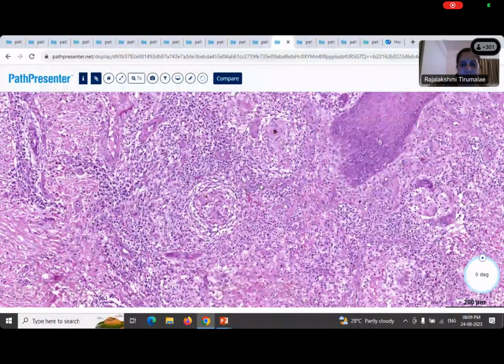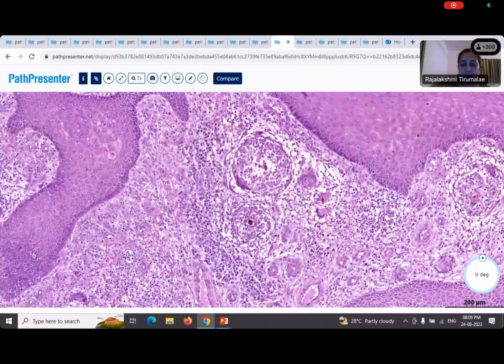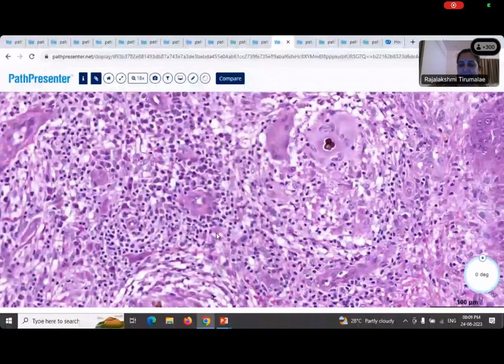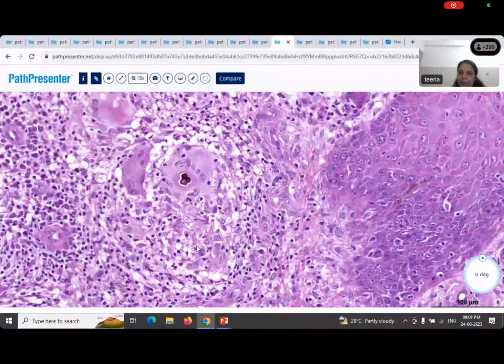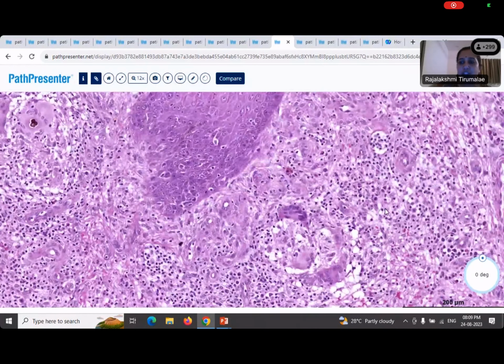And you have a cuff of lymphocytes around some of them. Some of them don't have too many lymphocytes. So this is an epithelioid pattern of a granuloma that you're seeing. And you rightly said there are several giant cells. Anything else which is striking in this case? Some pigmented fungal sclerotic bodies. Yes. So you are seeing within the giant cells they have engulfed these sclerotic bodies, or medlar bodies, or copper pennies, which are brown in color.